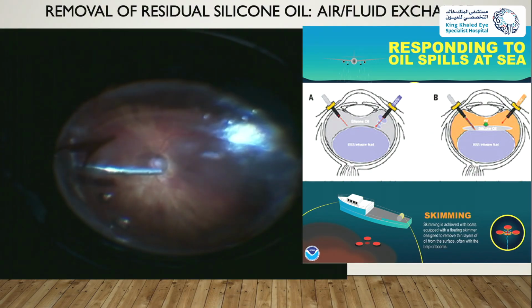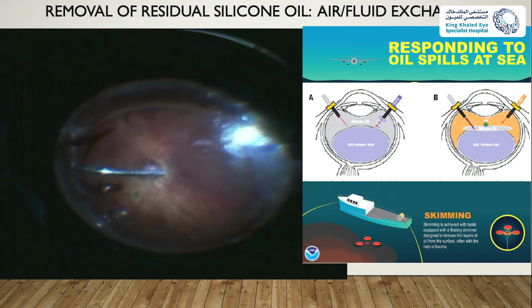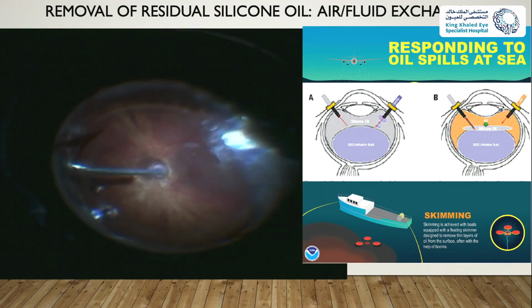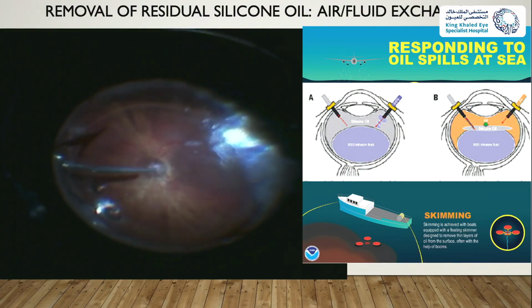Then I've stopped. Because I don't want to aspirate air, because if you aspirate air, the eye gets soft, and the machine will tell you you are bringing the eye too soft, hypotony sets in. So you keep repeating, touching the interface with the cannula and the flow of your aspirations, and then stopped.